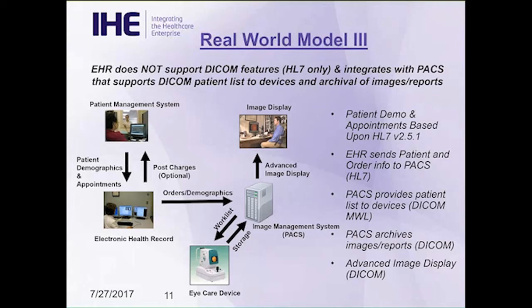Now, the output is the same as Real World Model 1, right? I do my DICOM store. The PACS takes responsibility. And, of course, we have the ability to display the data. So what's important for you now, as a clinic or as a vendor, is to look at these models and find out which model fits you the best, and then you purchase your products based on those models.